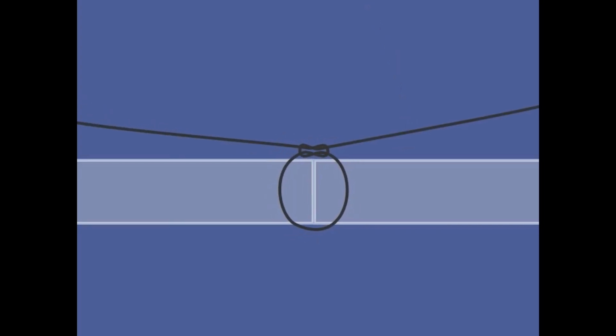If it is pushed straight or dragged shallow, the edge position will be wrong. For even apposition, gently evert the edge by a moderate amount, then rotate the needle so it enters at about a right angle to the tissue plane. Do the same on exit, a smooth wrist rotation that brings the needle out at about 90 degrees. The result is what the animation shows here. The edges meet evenly, with neither edge being pushed up or pulled down.